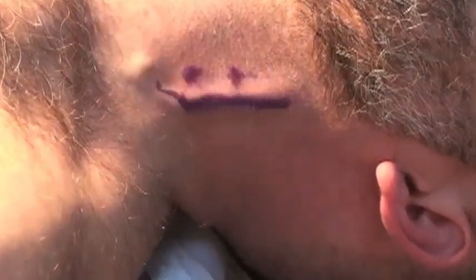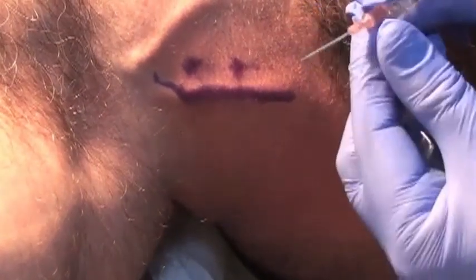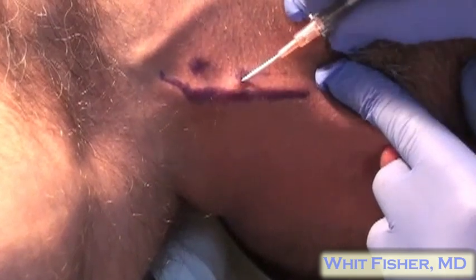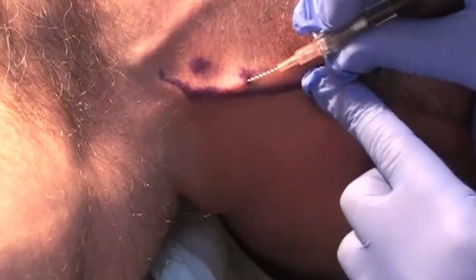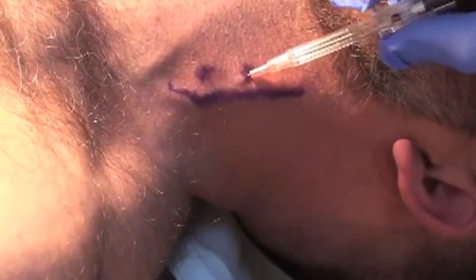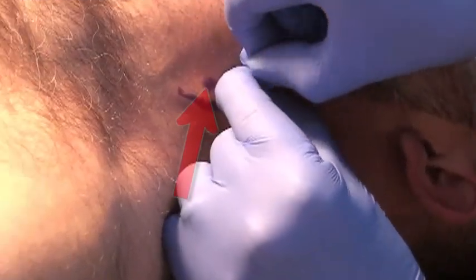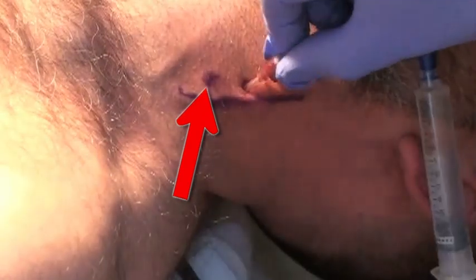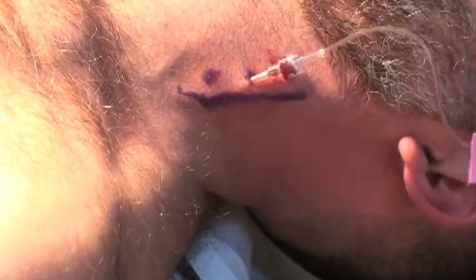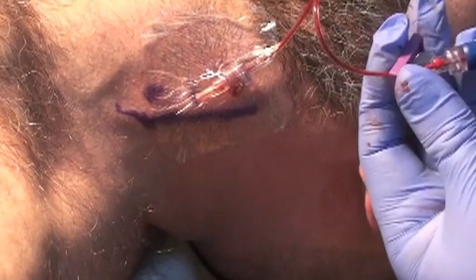So when you're finally ready to place the IV, lie your patient flat and try and have them Valsalva once more. Then insert the IV right at one of the local anesthetic injection sites so it doesn't hurt the patient and you can manipulate your IV as needed. Remember, this is a very superficial vein, so don't go in too deep. If you don't get it on the first try, you can try again in the same place or move down to your second local anesthetic injection site. Remember that EJs don't always flash the way regular IVs do — so if you think you've got it in but don't see a flash, just remove the needle and try to withdraw your angiocath a little bit at a time to see if you get good blood flow.